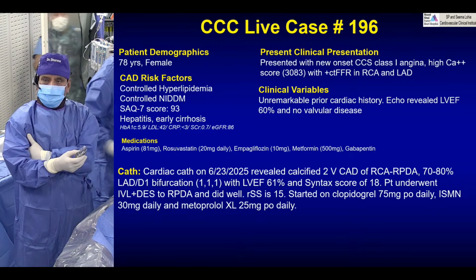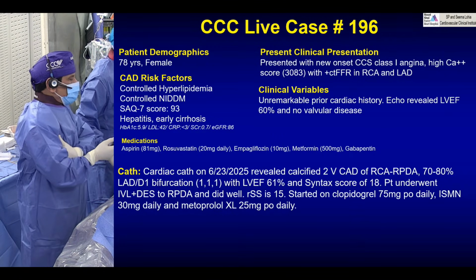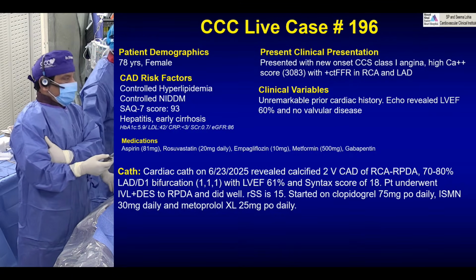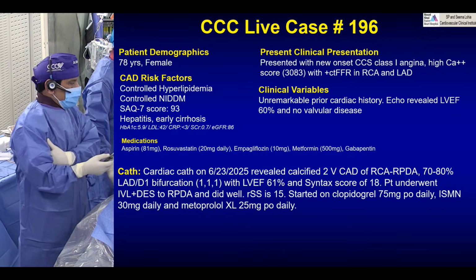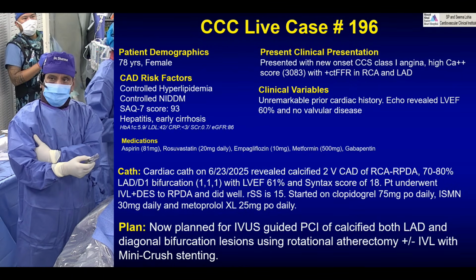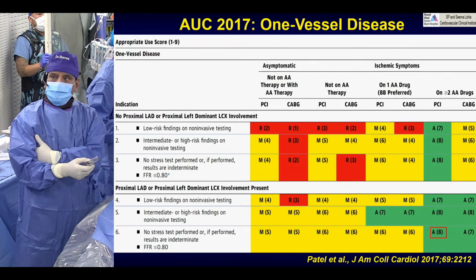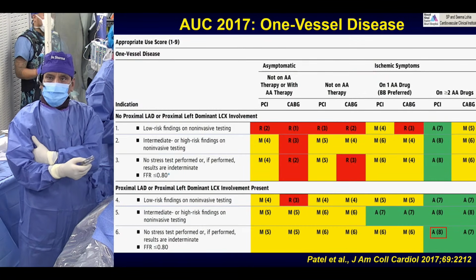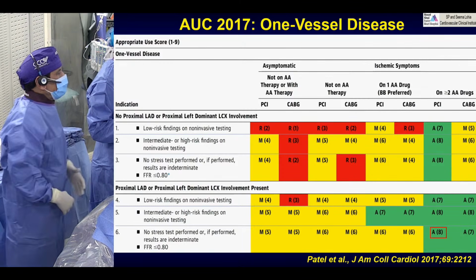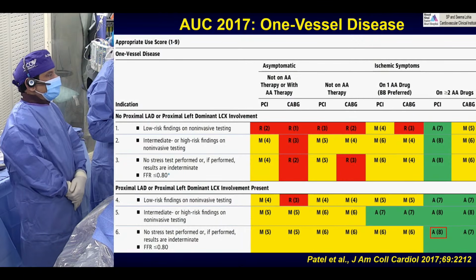The patient had a PCI of the PDA and was started on clopidogrel. We always do the PRU, which is 169. Anything less than 238 is good. The patient is here now for the intervention of this, both imaging guided, both the LAD and diagonal bifurcation. It is appropriate because of failed medical therapy, and the patient has an FFR of less than 0.8.